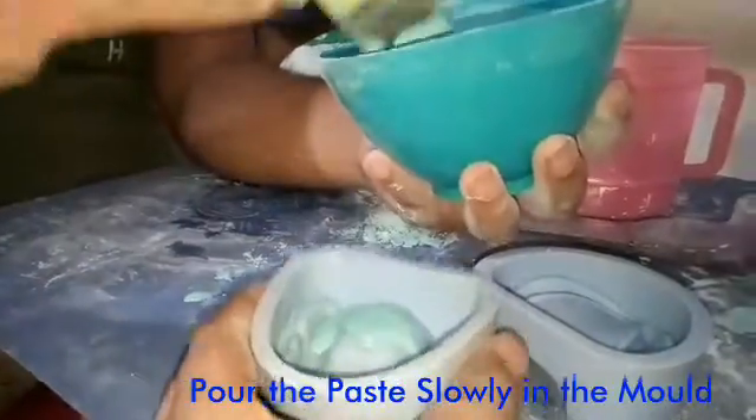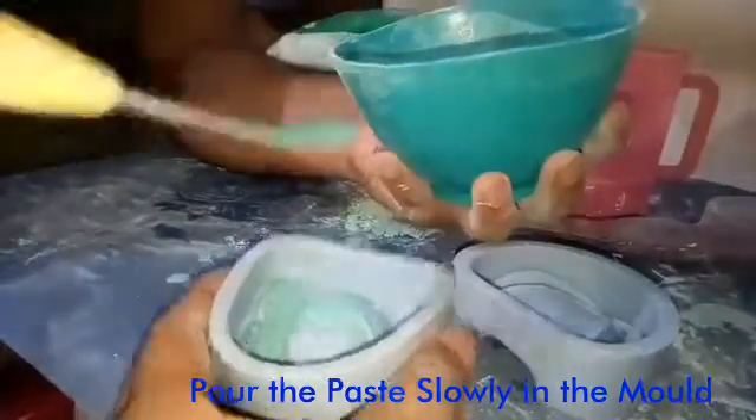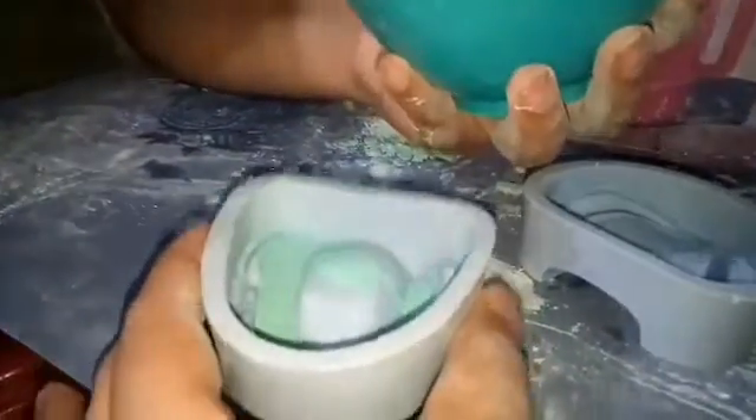Pour it slowly into the mold and hit it like this so that the mixture goes thoroughly into the mold and there will be no gaps in the mold.